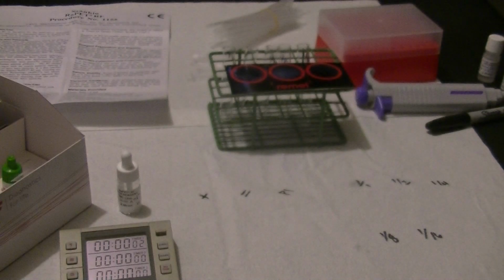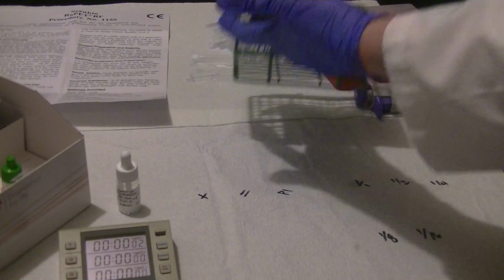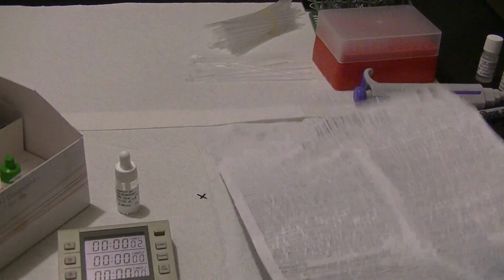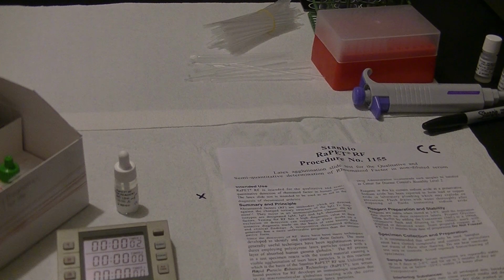Now, 6 months down the road, if we tested this patient again, and their level was positive all the way through the 1 to 16, for example, we would know then that that person was starting to make more rheumatoid factors. So their arthritis was basically getting worse.